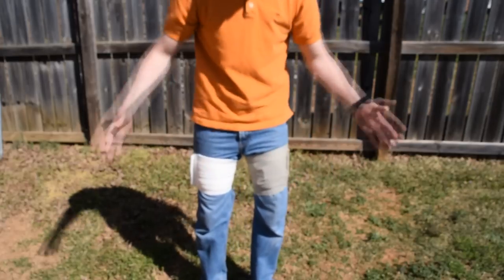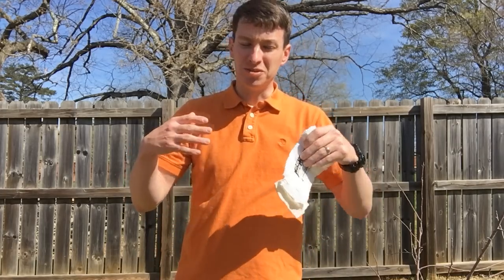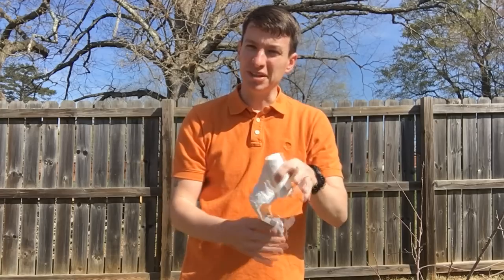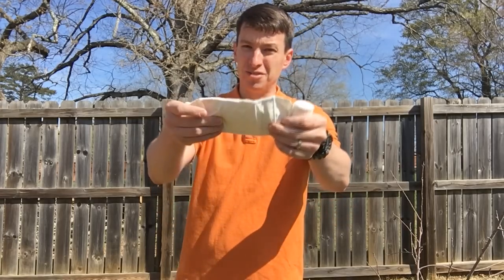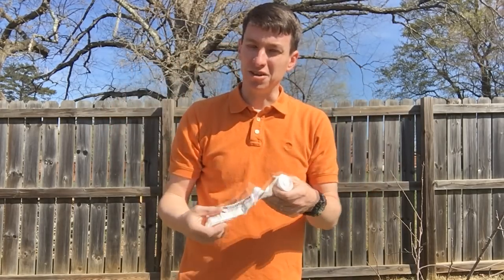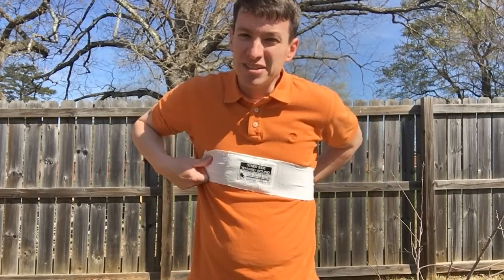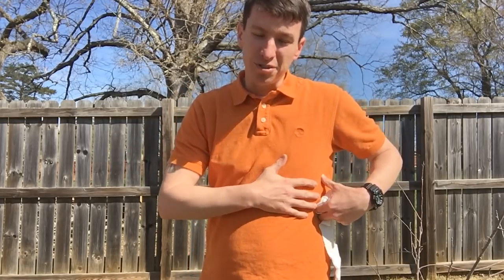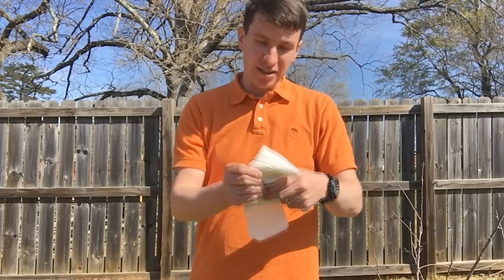You could use this on extremities as well. You can bandage a head — if you've got a head injury, they're going to bleed pretty heavily, so you can wrap this bandage around the head just like you would any other wound. Chest area as well — it's going to be kind of hard to wrap by yourself. If you get a flail chest with multiple broken ribs, you can splint that using a bandage like this.